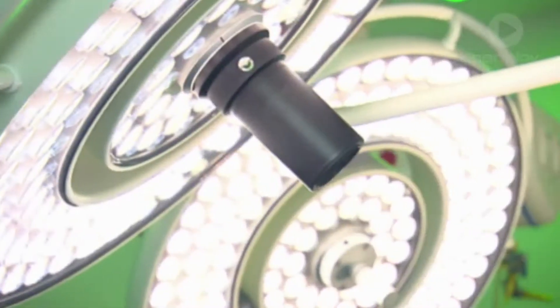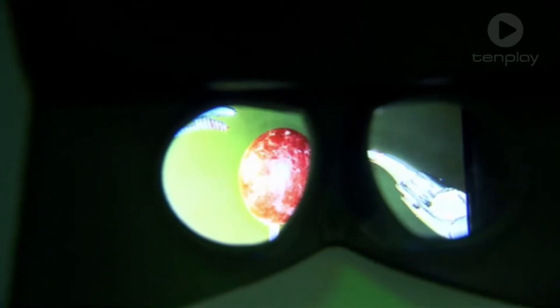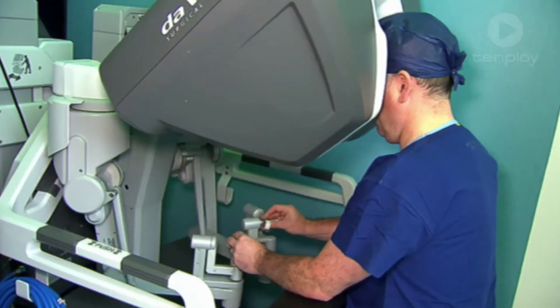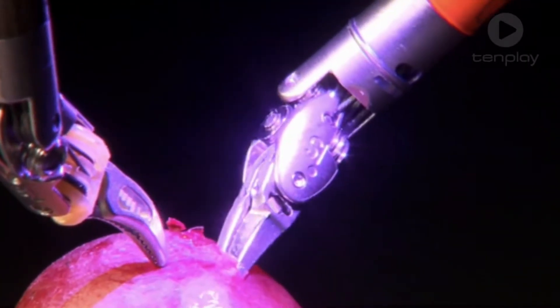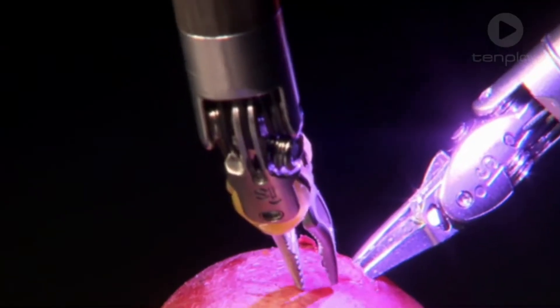Normal surgery only shows us images in 2D, but our robot has two cameras that see in 3D, just like a pair of human eyes. When the surgeon operates the robot, they are able to see very clearly inside the body in spectacular 3D vision. The robot's cameras can also magnify up to 10 times.